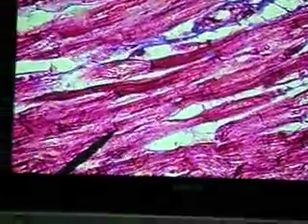But at the same time, we have lost out in what? Not seeing what, Roy? The nuclei. So we have lost out. This stain is not picking up the nuclei. Now, Kim in the green, what about the nuclei in cardiac muscle? These are round, centrally placed nuclei.